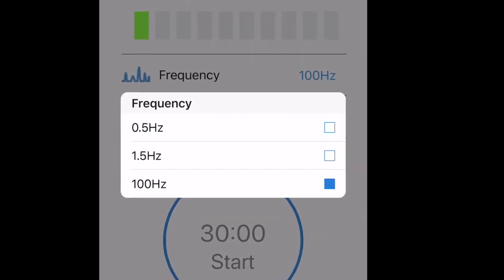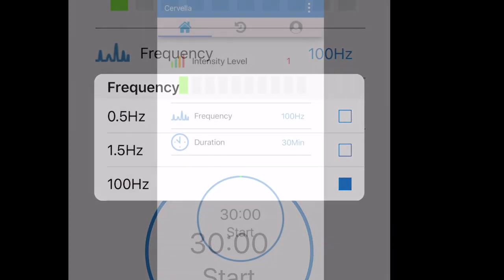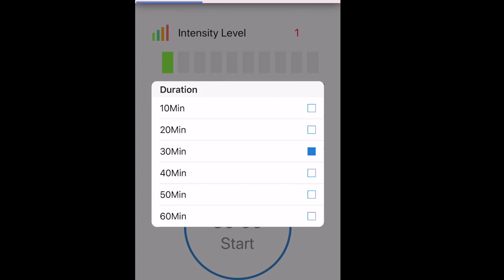If the default frequency is not effective, try 0.5 Hz or 1.5 Hz. Next, select the duration of the treatment. The optimal and default treatment duration is 30 minutes.